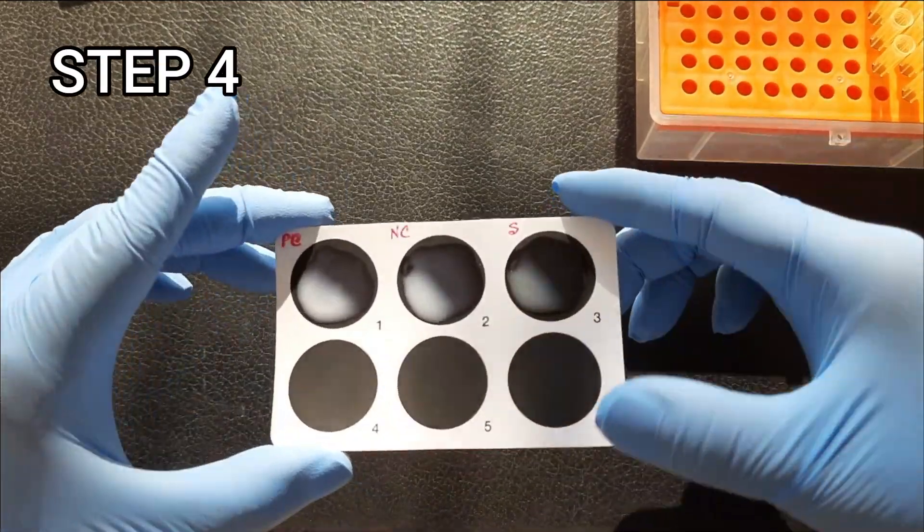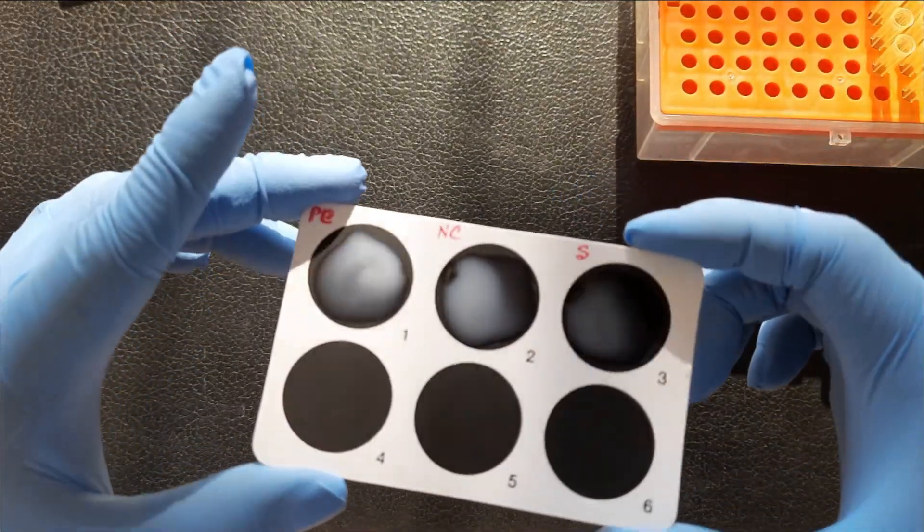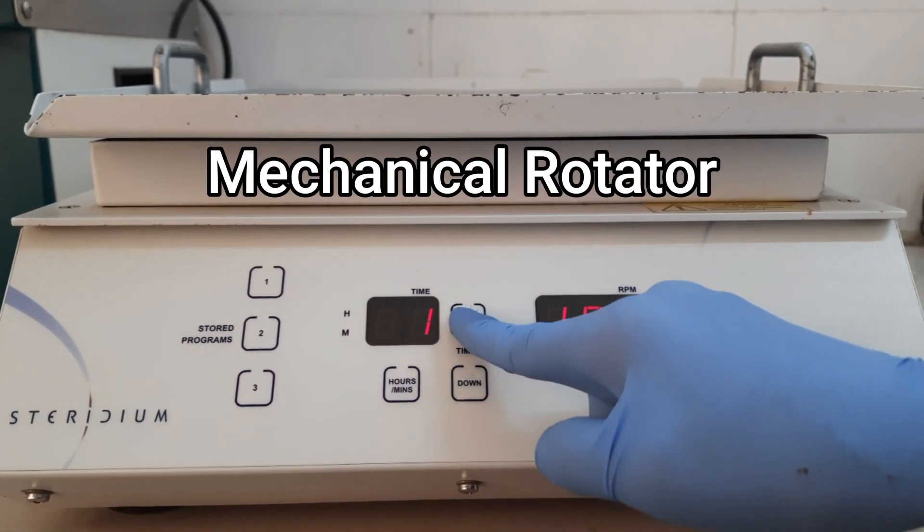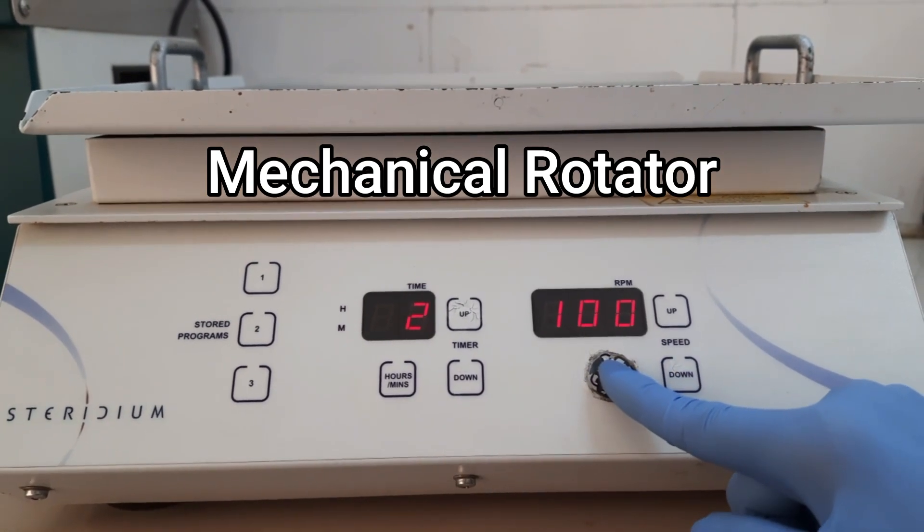Step 4. Rock the slide gently back and forth, or place the slide on a mechanical rotator at 100 RPM for two minutes and observe for any agglutination with the naked eye.